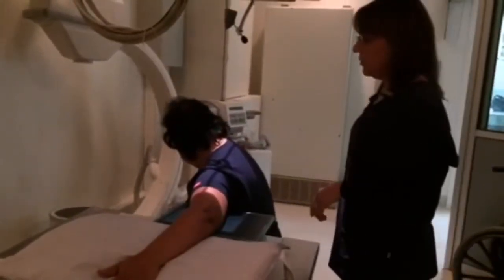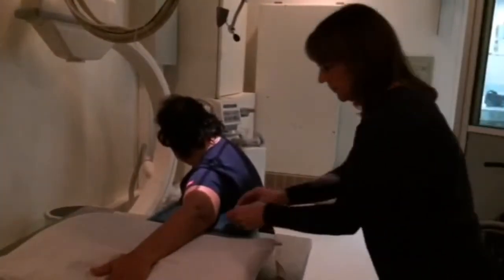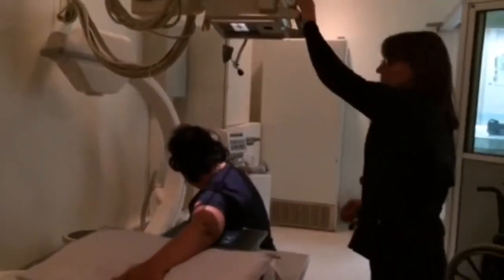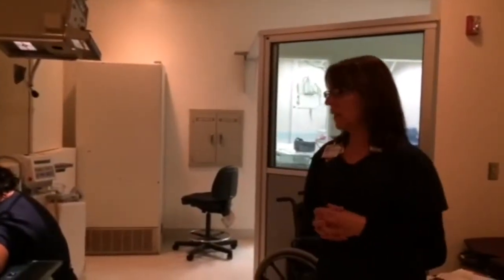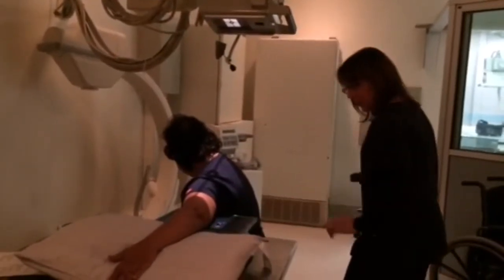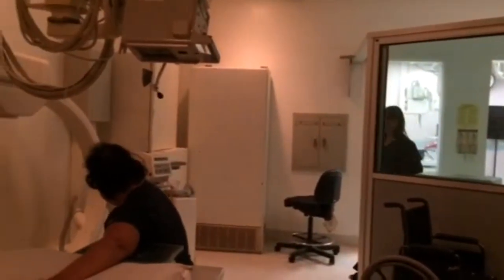All right. So my central ray is entering the shoulder joint. My patient is looking down and away. I have my left marker on the 8x10. My patient is shielded. I've collimated. That looks good. My technique for this view is going to be 70 at 7 mAs. Okay. So Mrs. DeWitt, I need you to hold very still. And I'm going to expose. X-ray. Beep. Okay, Mrs. DeWitt, you can relax.